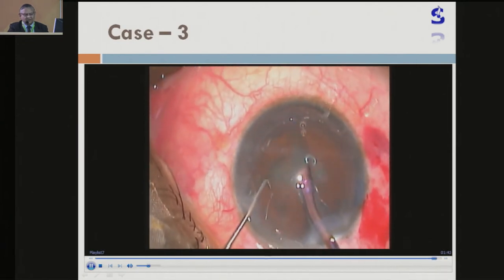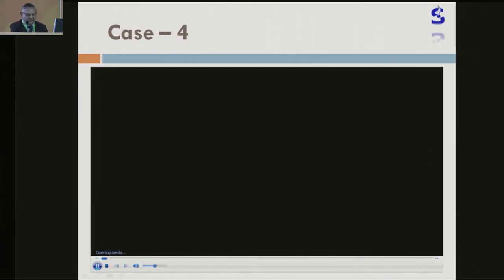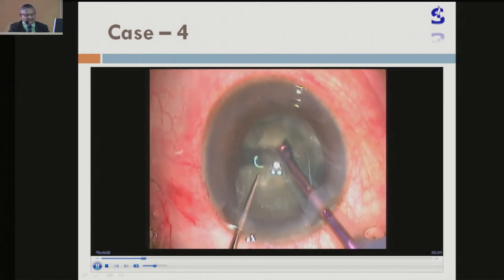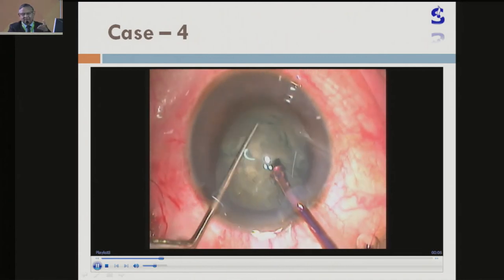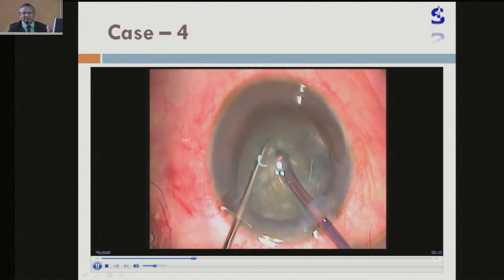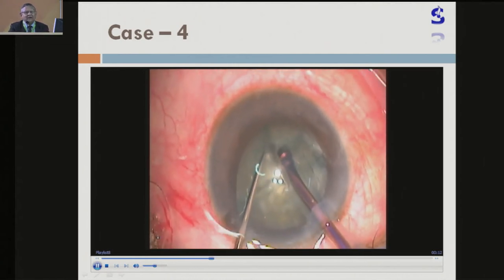During the last video, Dr. Arbanzal mentioned you can reduce the parameters — reduce the vacuum, reduce the power — like this. See, I wanted to make it vertical but it went horizontal; nothing wrong with that. And then you can rotate the nucleus and accordingly you can do that.